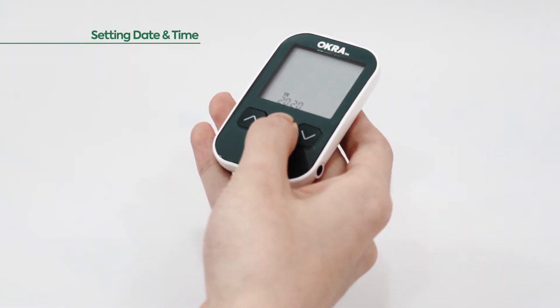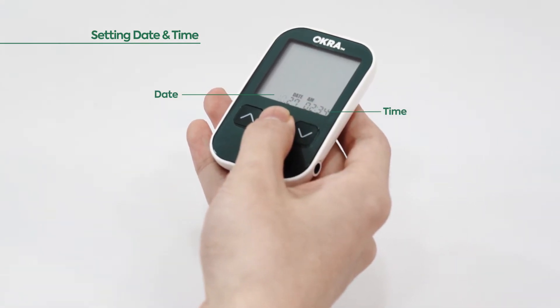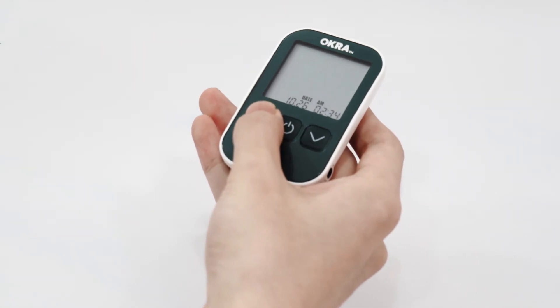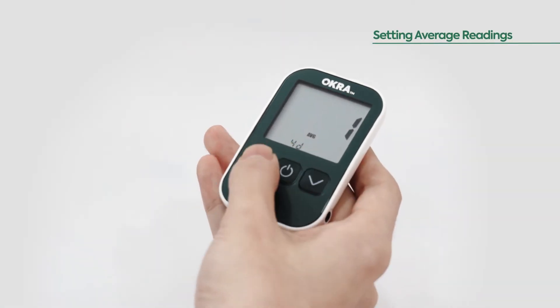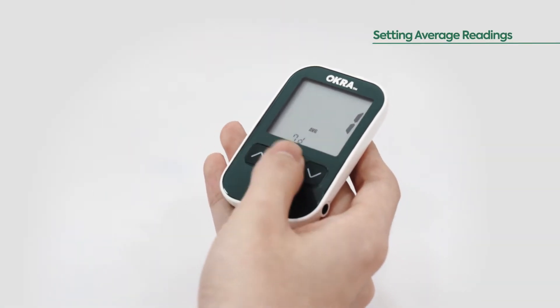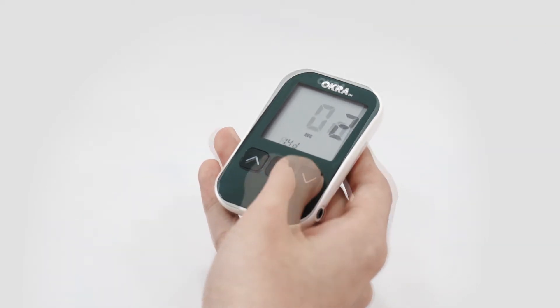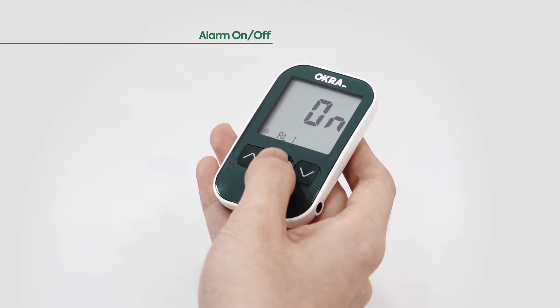Next, choose the desired number of days for your average readings with the up and down buttons, then press the power button to save. Next, select the alarm mode on or off with the up and down buttons, then press the power button to save.